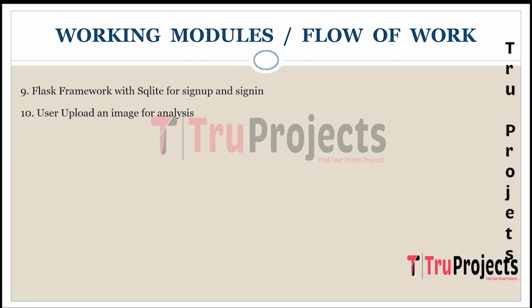Users can upload an image that they want to analyze. The uploaded image is then processed and prepared for analysis. The given input is pre-processed. The uploaded image is pre-processed as needed for the chosen image classification model. This could include resizing, normalization, or any other necessary transformations.